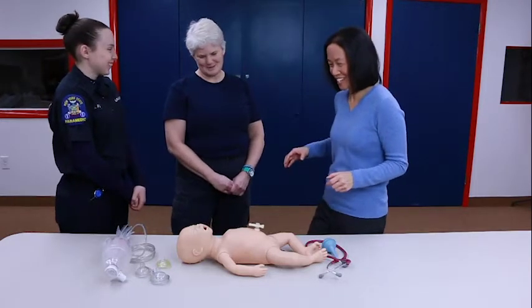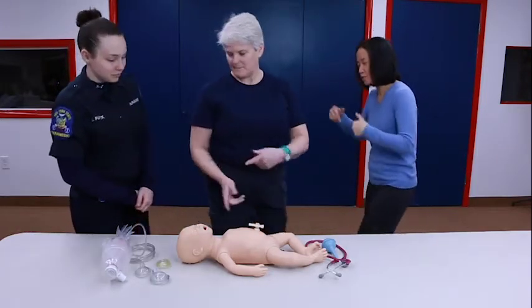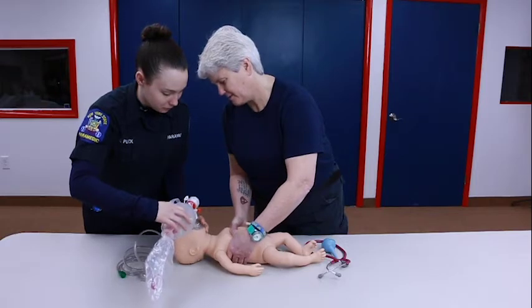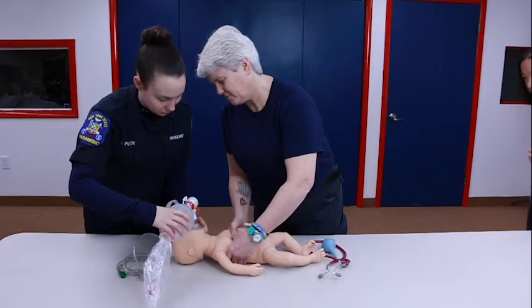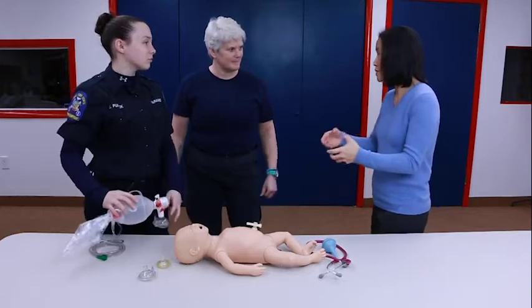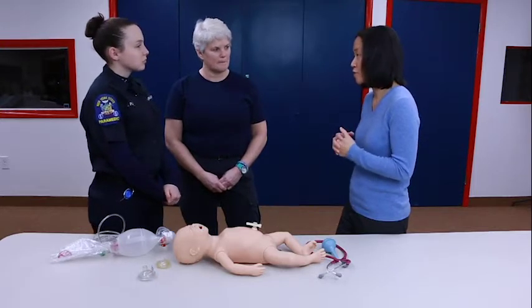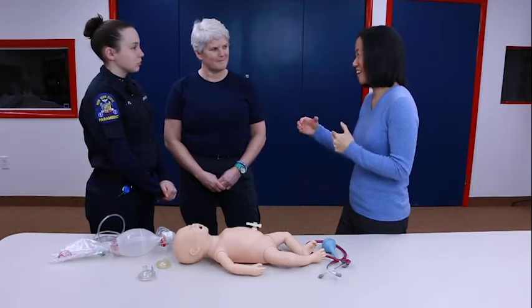You ready to get your hands on the baby? Why don't one of you bag and one of you do chest compressions, then we'll switch off. One and two and three — one and two and three — one and two and three. That's a great rate, great depth, good coordination. Usually the person doing compressions is counting out loud so that you stay coordinated, and the person who's bagging is making sure you're coordinated as well.